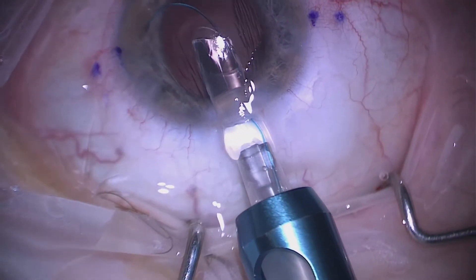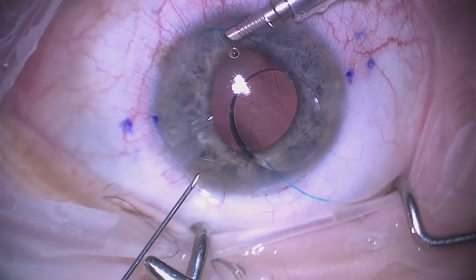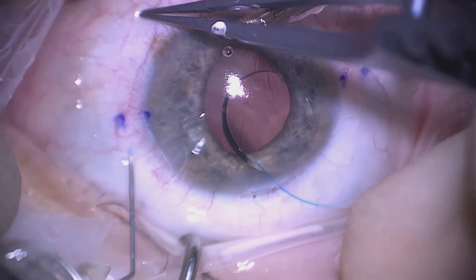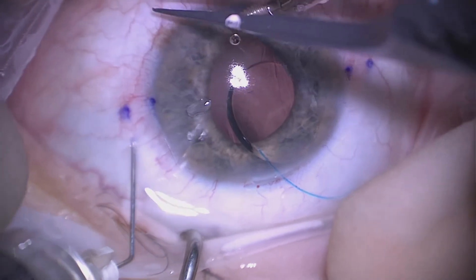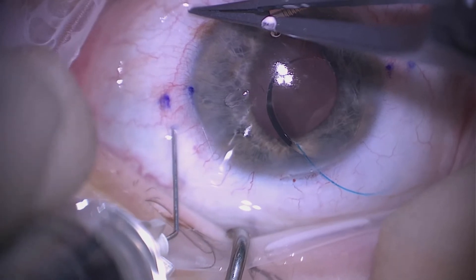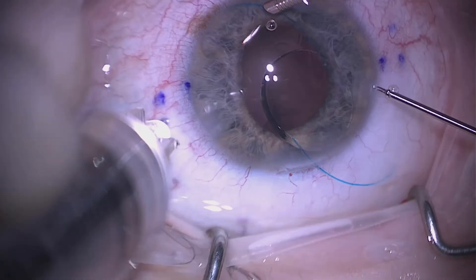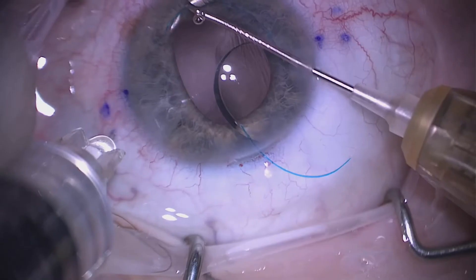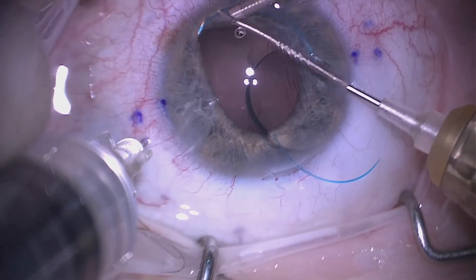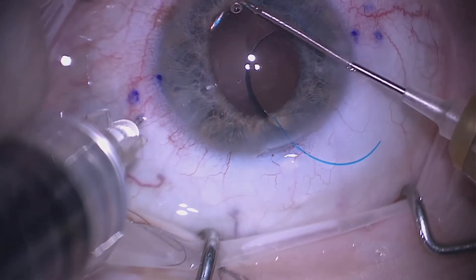We're careful to maintain the exact angulation so that the lens does not drop into the vitreous cavity. Keeping the trailing haptic outside the eye also helps. We then bend the 30-gauge thin-walled needles — this is the first needle — and create a track, then dive into the posterior segment taking a perpendicular approach. We use 25-gauge micro-graspers, which are very useful for manipulating the haptics.